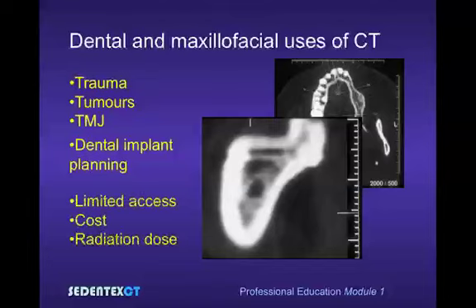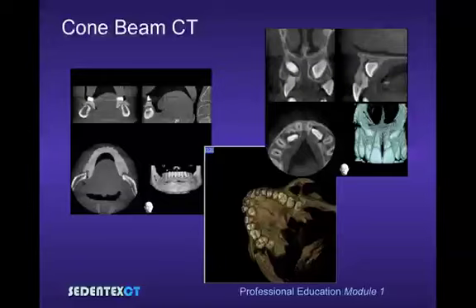Unfortunately, conventional CT scans have limited access for dentists. They cost a lot of money, and the radiation dose associated with the use of these scanners has also caused concerns about overusing them. This situation changes a little when we think about cone beam CT.